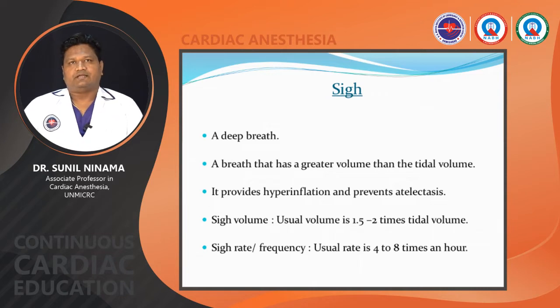What do we mean by sigh? A deep breath, a breath that has a greater volume than the tidal volume. It provides hyperinflation and prevents atelectasis.